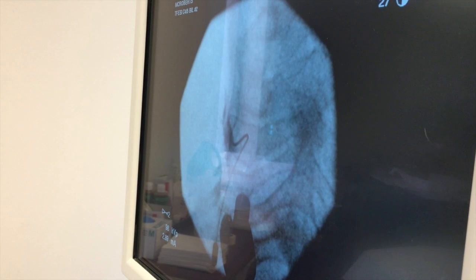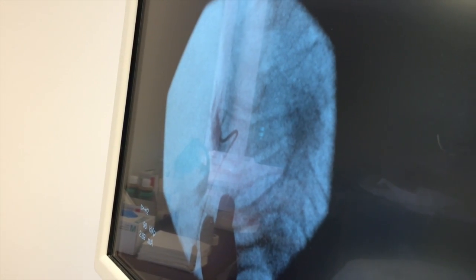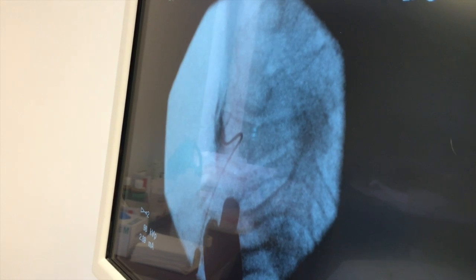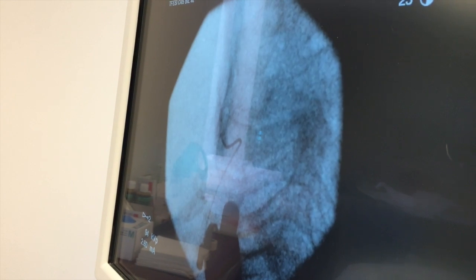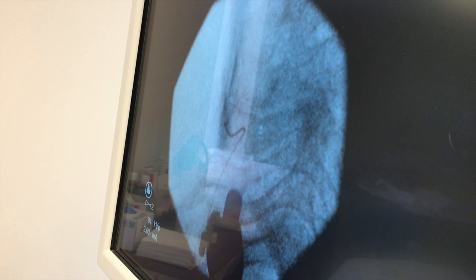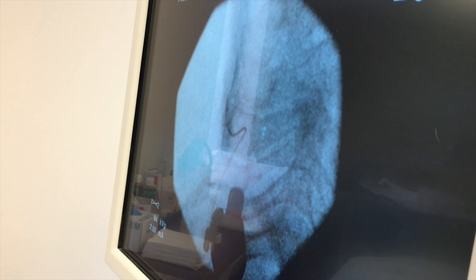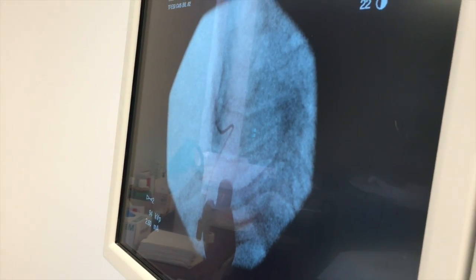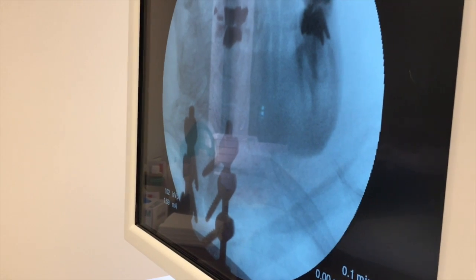No blood vessel. Wonderful. And then we come back and we inject a little bit of what's called dexamethasone, which is a very strong anti-inflammatory medicine dedicated to reducing inflammation around the nerves coming out. And we're done on that side. That's one side down. You did beautifully. Thank you very much.